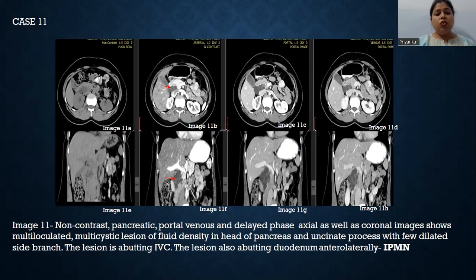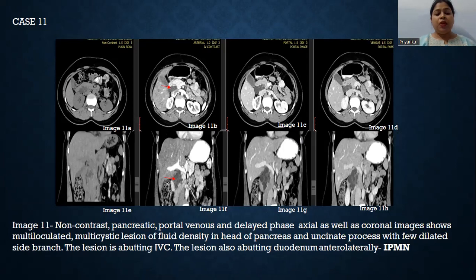Case number 11: Non-contrast, pancreatic, portal venous, and delayed phase axial as well as coronal reformatted images show a multi-loculated, multi-cystic lesion of fluid density in the head of the pancreas and uncinate process with few dilated side branches. The lesion is abutting the IVC and also abutting the duodenum anterolaterally. Findings are suggestive of IPMN.